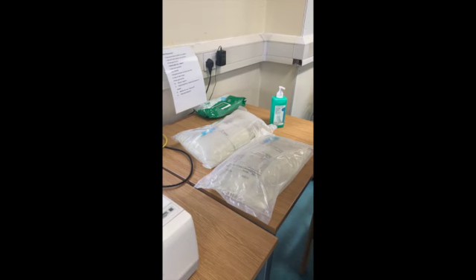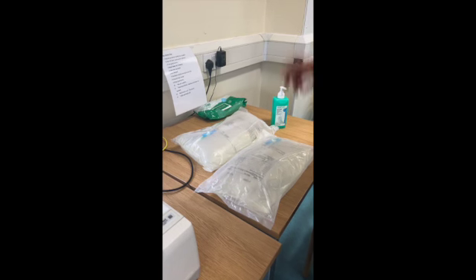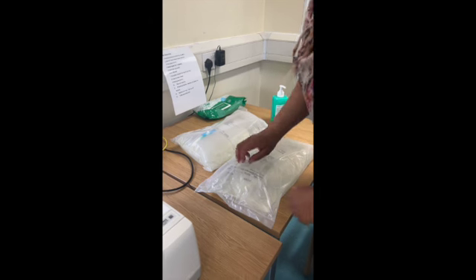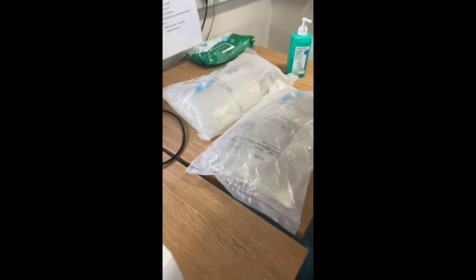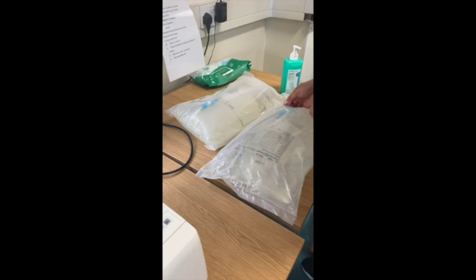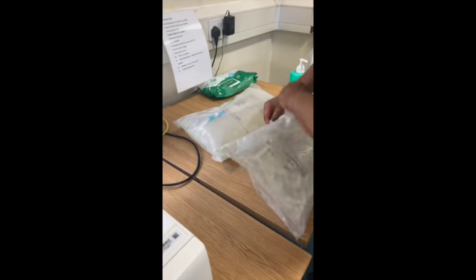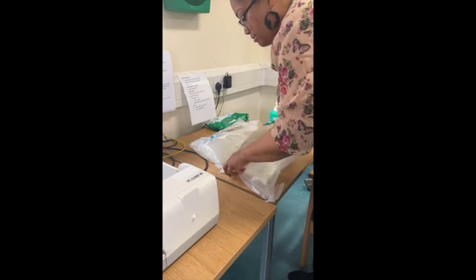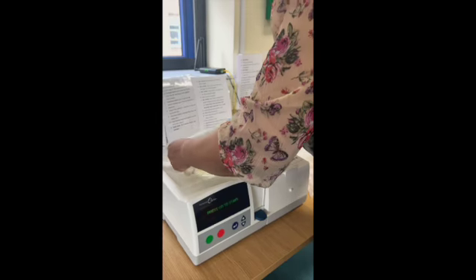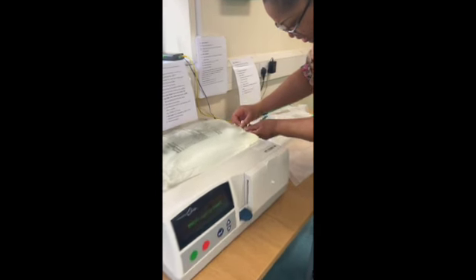So the next thing I have to do is put the bags onto the machine, but before I can do that, I have to check the expiry date and also that it is the correct fluid. So the expiry date at the top, and yep, that's the correct fluid. To tear open the bag, there's a small slit and a larger slit. I'm looking for the larger one, and then I can tear this off. And I have to make sure that this is sufficiently hanging down.